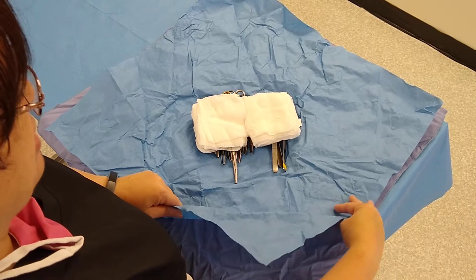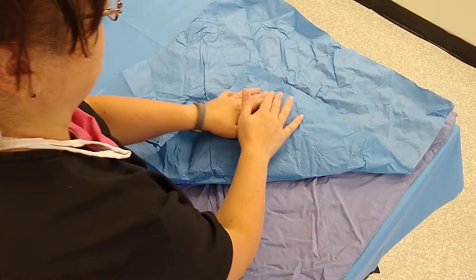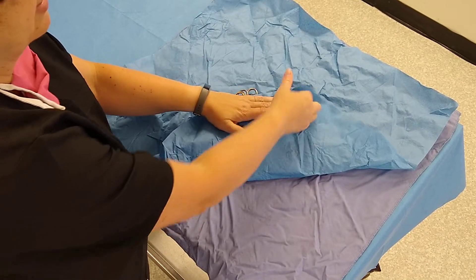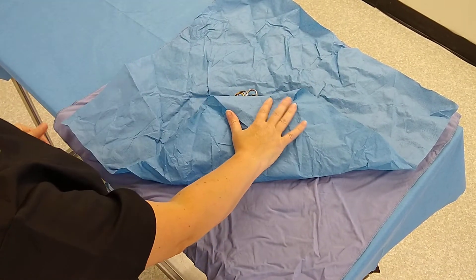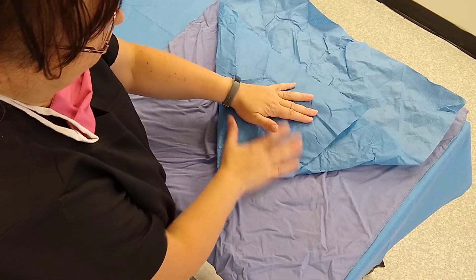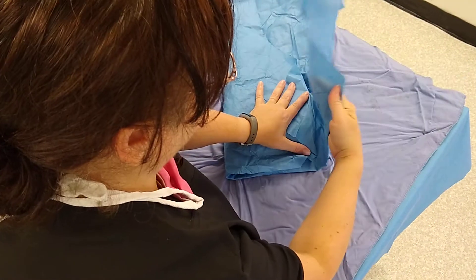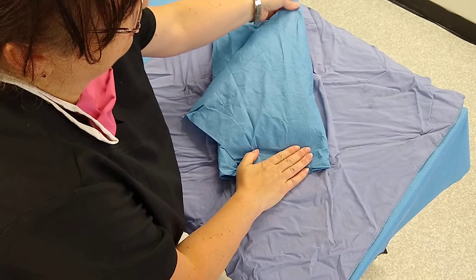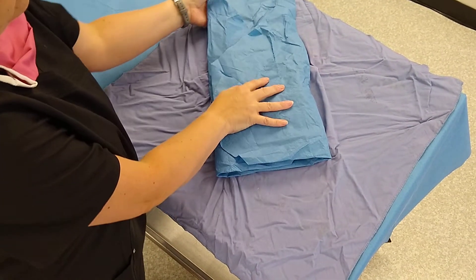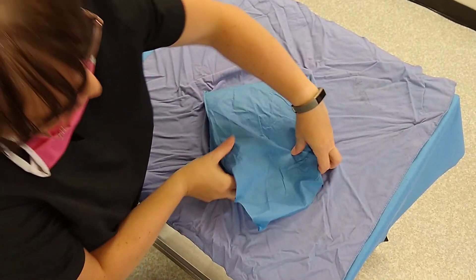Start your wrapping process using that same diamond pattern. The bottom edge is going to come up — notice I'm not yanking my flaps up, I want to keep my instruments nice and straight. Bring it up and over and tuck it into the cave. There's your inner wrap — that will be the pack that only sterile people can touch.